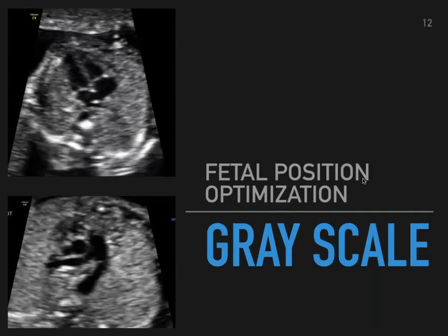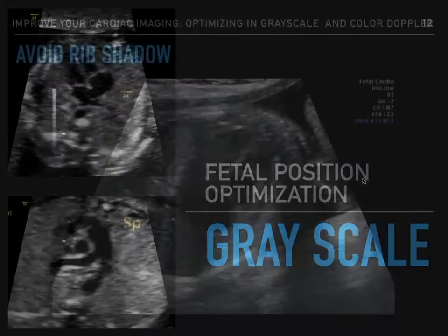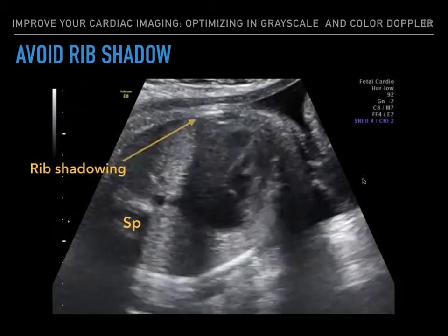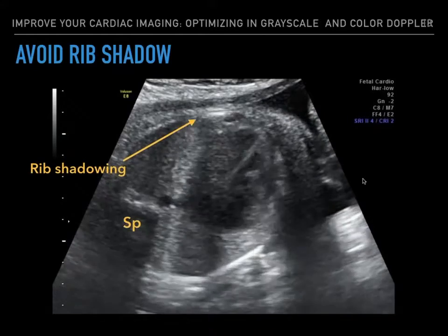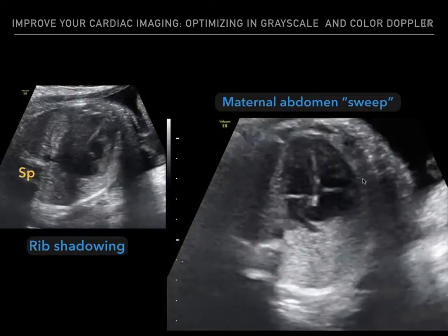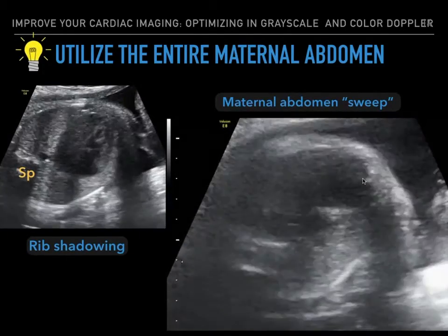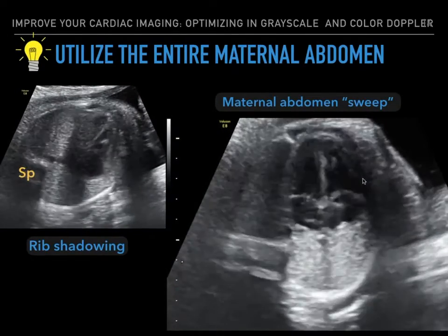Fetal position optimization in grayscale. One of the many challenges that we encounter is fetal positioning, especially with rib shadowing in the way, as you can see here. Now, how can we avoid this? How can we actually improve this image? What you could do is utilize the entire maternal abdomen. You want to sweep your probe high, you could even sweep it low, move over to the maternal left and right, and explore your different angles to avoid the rib shadowing.